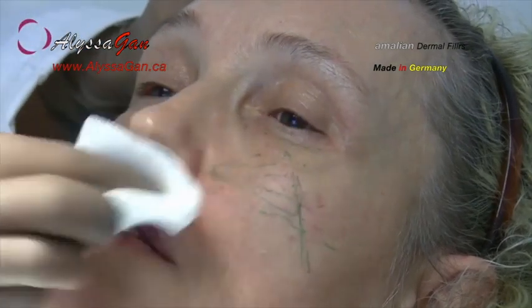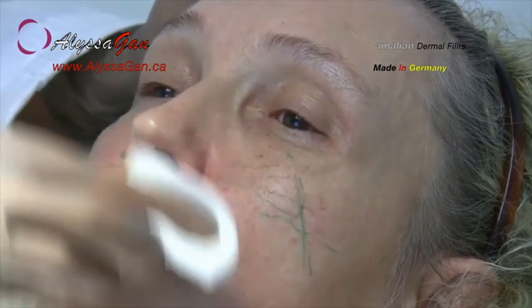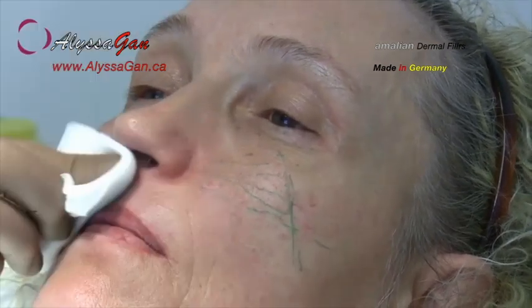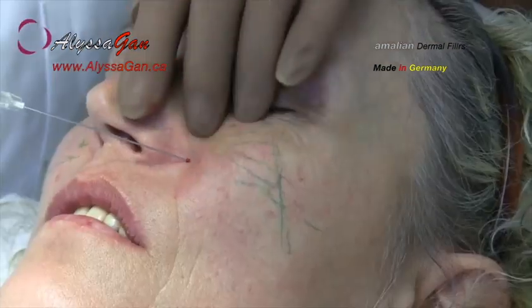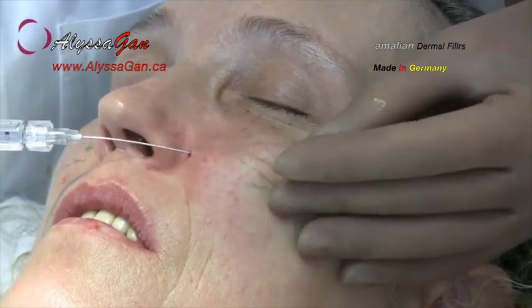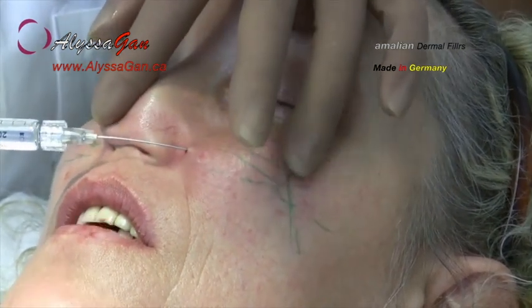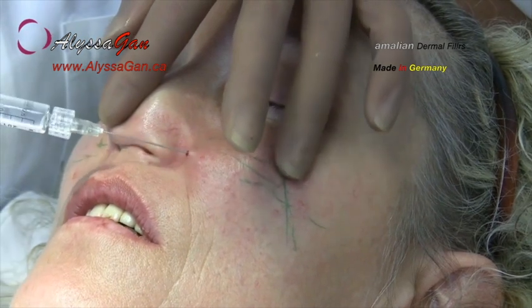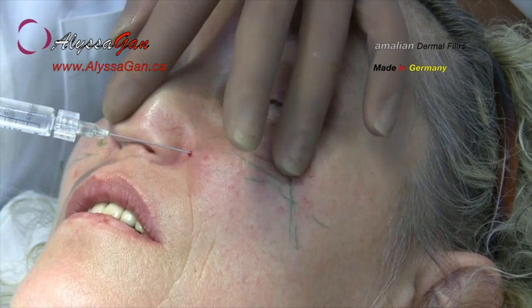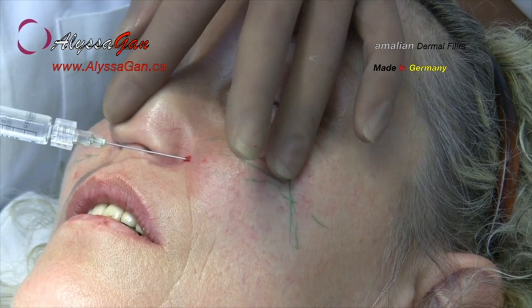Prior to treatment, thorough disinfection of the whole area is required. Any unwanted contact of the non-sterile skin with the cannula may render the treatment non-sterile. Injection is made using a 22-gauge cannula. Naturally, this is a blunt cannula to avoid damage to the tissue. Care must be taken to avoid contact of the still visible parts of the cannula with the skin surface throughout the treatment to guarantee ongoing sterility.